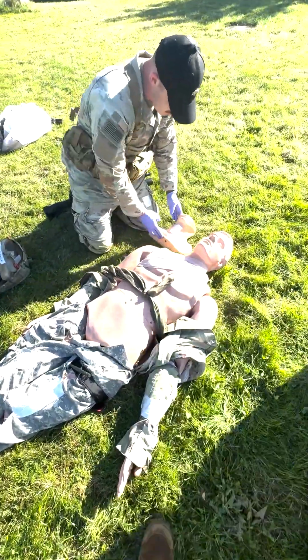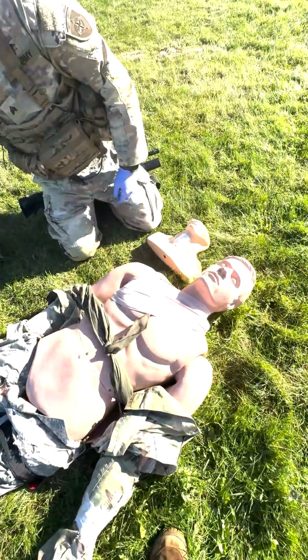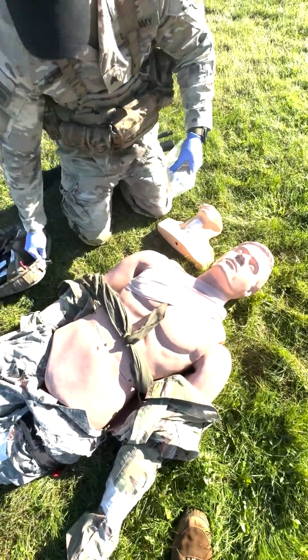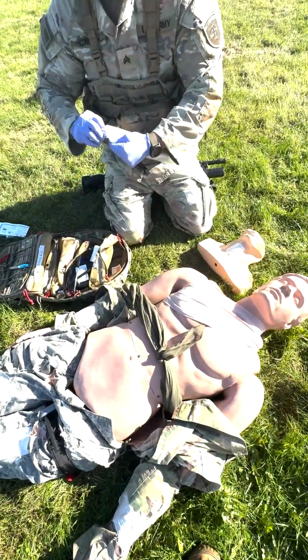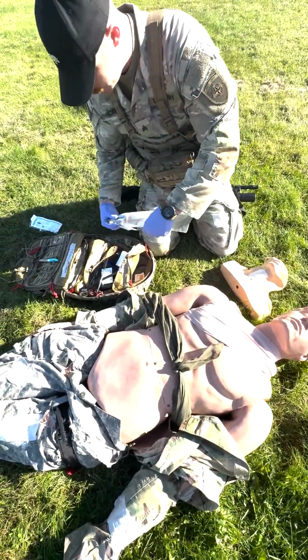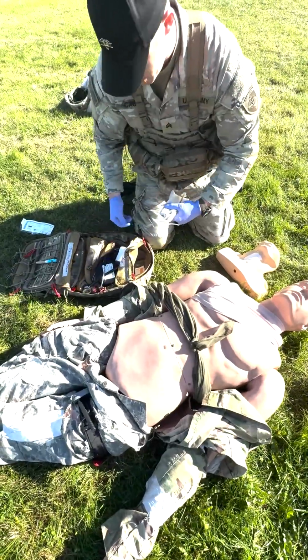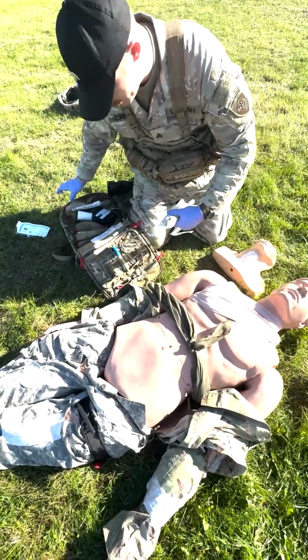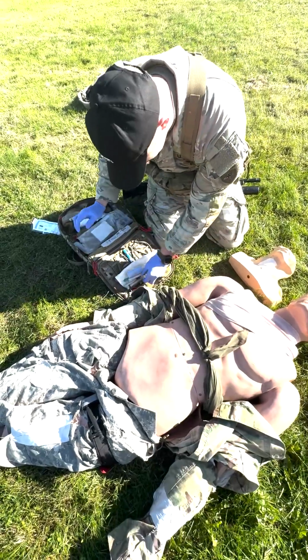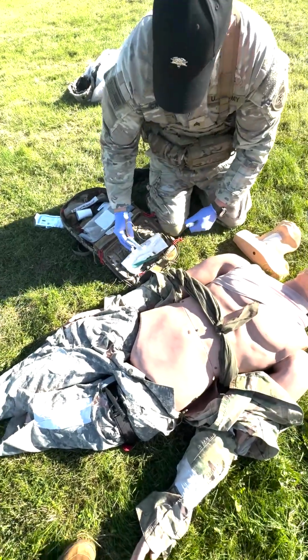Okay. I have my cric. I'm going to go ahead and prepare all my equipment. Alright, all my equipment.